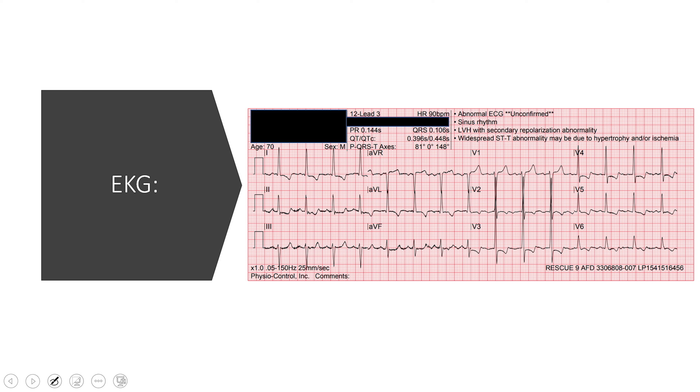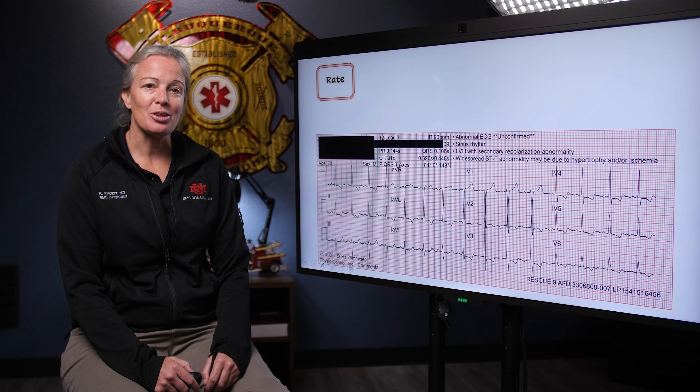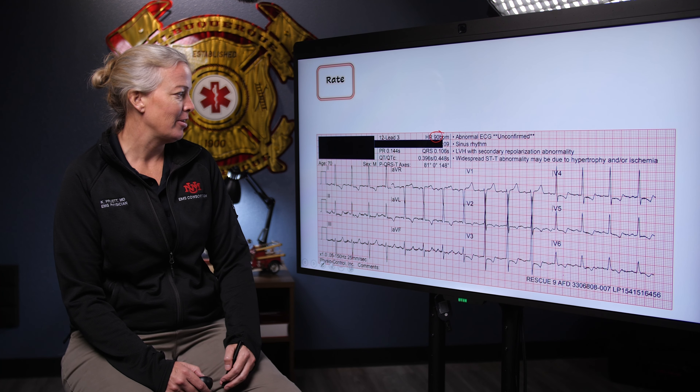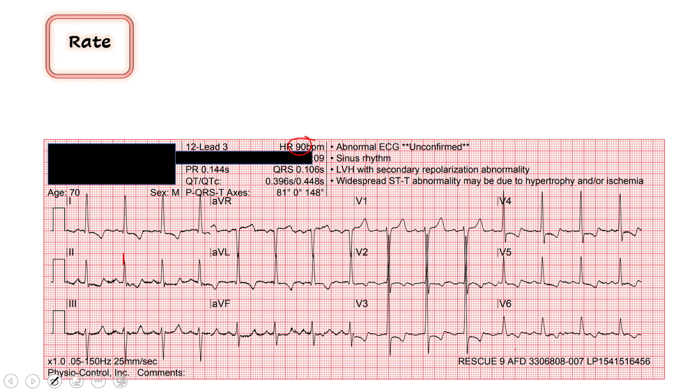I'll give you a second to take a look at it and see what you think. Alright, just like always, step-by-step we'll do this the same way together. We start with our rate. The computer is telling me we have a rate of 90. I'm going to find a QRS complex that lines up with a thick red line — this one lines up really nicely — and then we count down: 300, 150, 100, 75. So he's close to 100, just less than 100. I agree with the computer. Looks pretty consistent across the board, so we'll give him a heart rate of 90.